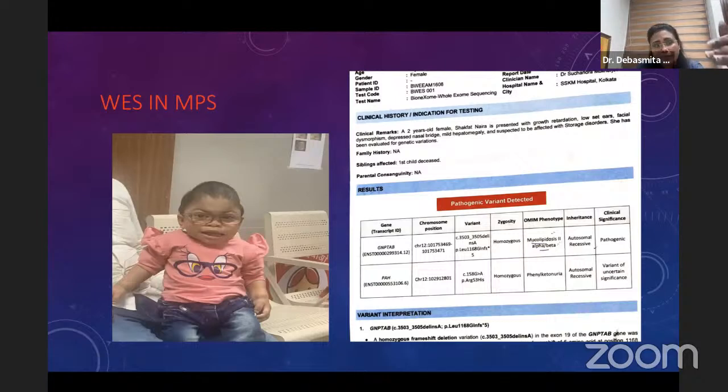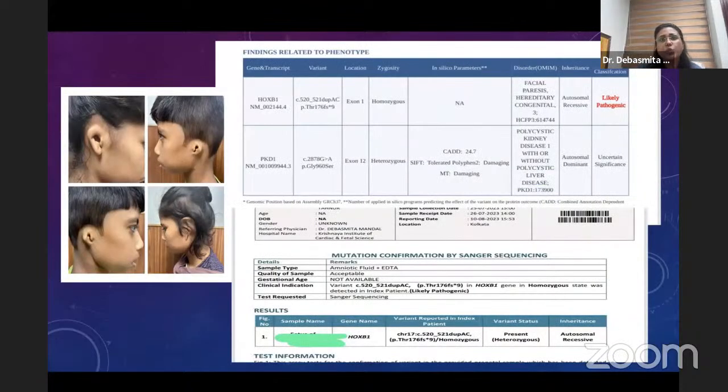That is quite good. But we can see the skull changes as well as the hepatomegaly and splenomegaly that has already happened to this baby. So the survival rate is very low right now. So this is a case of a recurrent microtia.